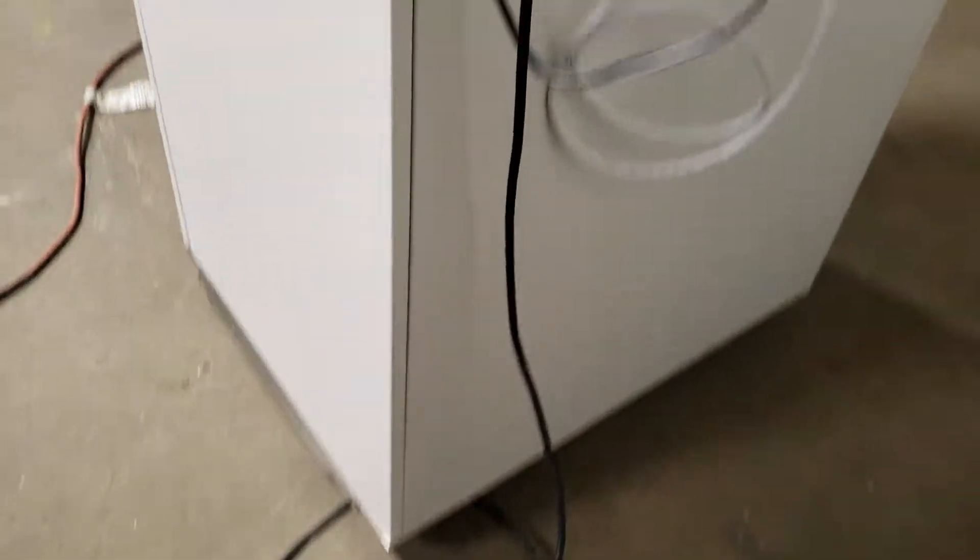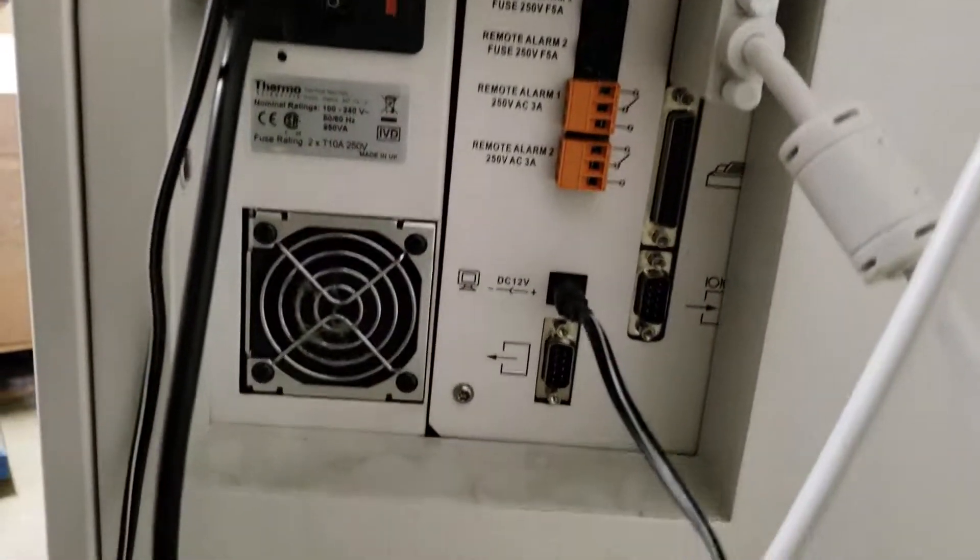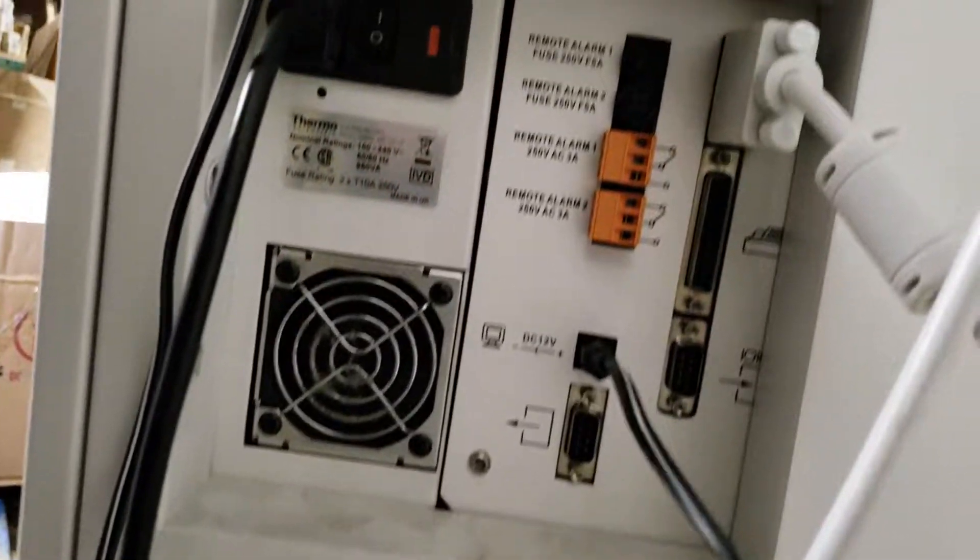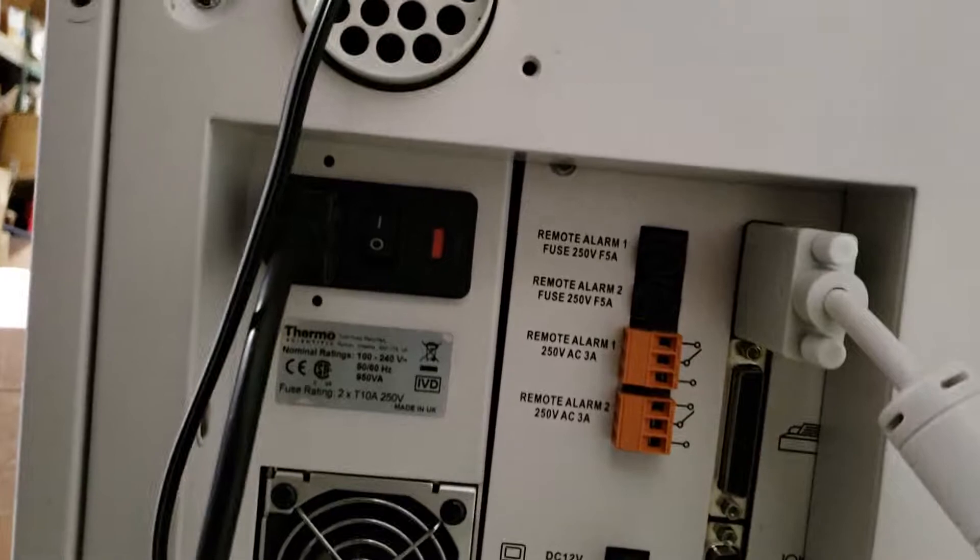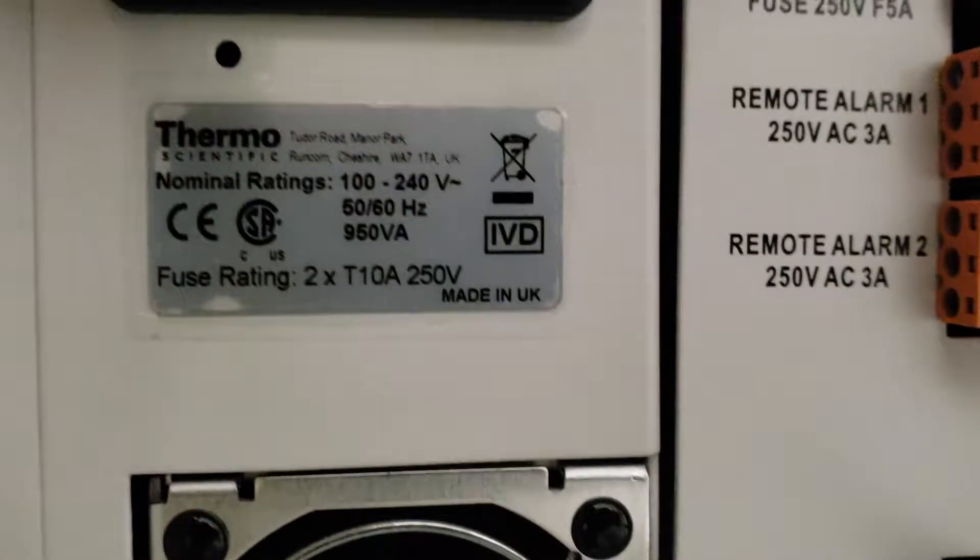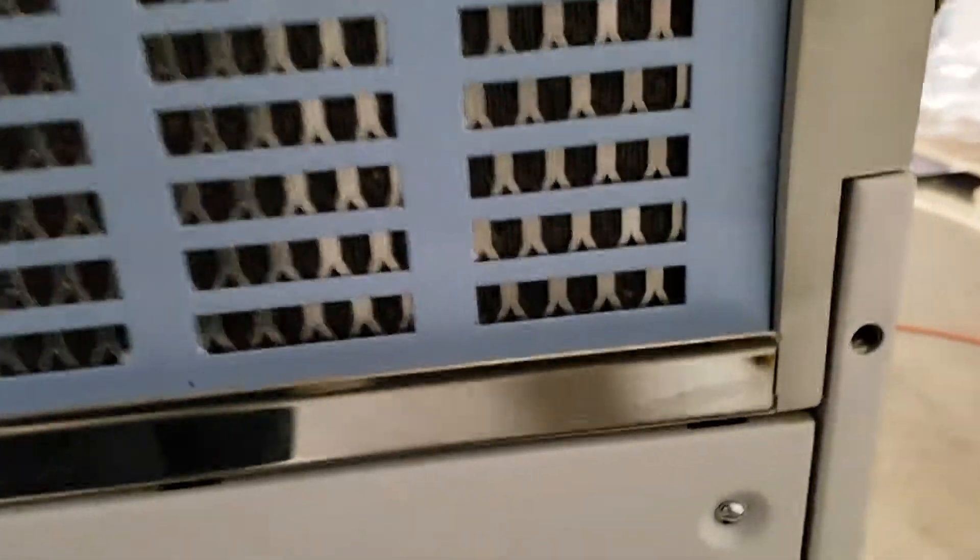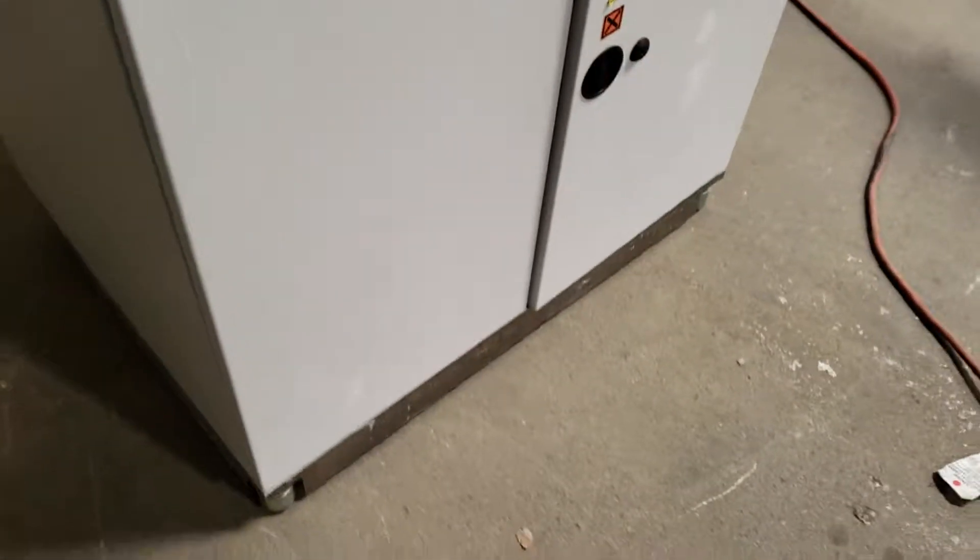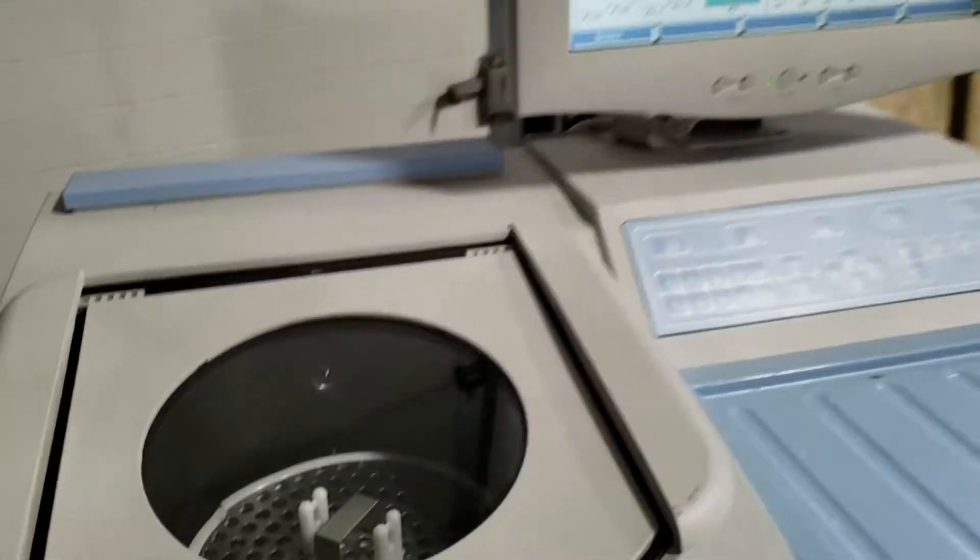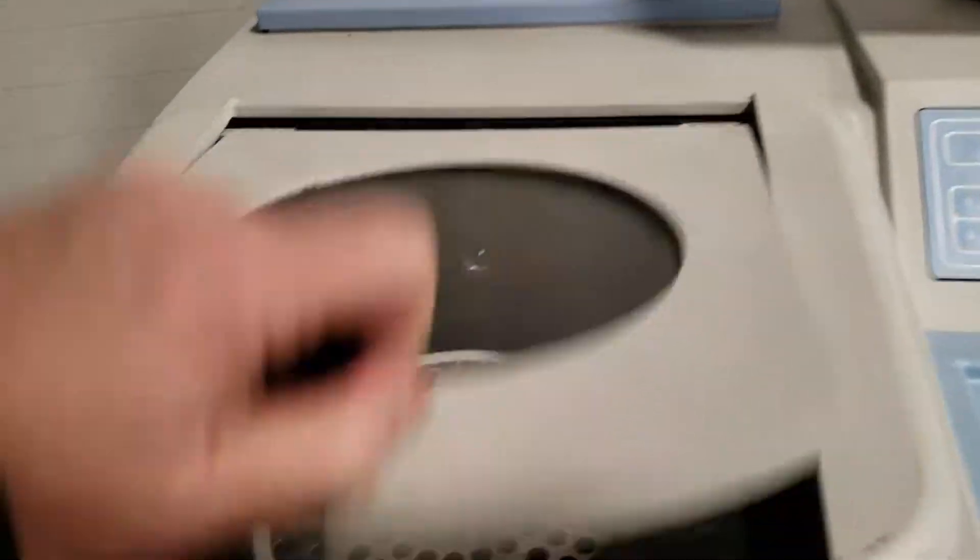Quick walk around the unit. That's the unit. If you have any questions, let us know.